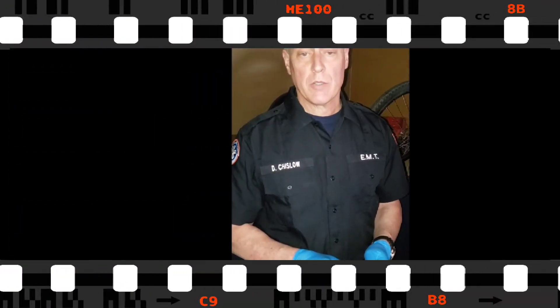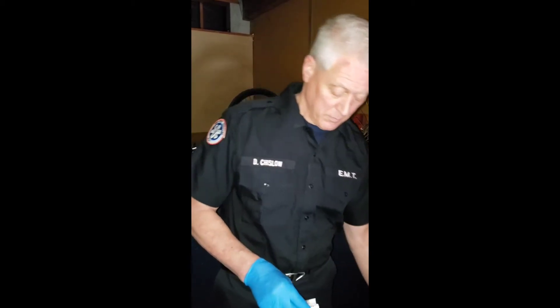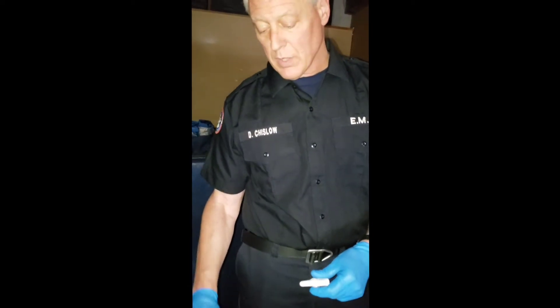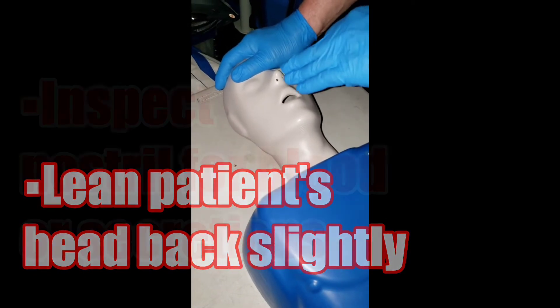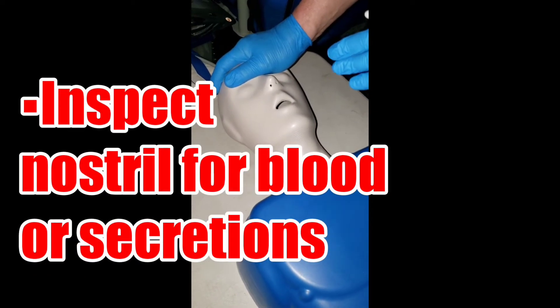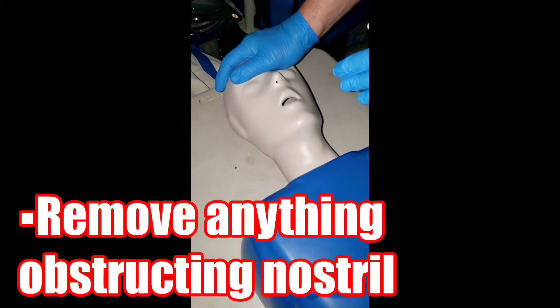To demonstrate usage of Narcan, remove it from its container. Make sure the patient's neck is in a stable, neutral position, slightly hyperextended — you're going to want to extend the neck slightly. Examine the nasal cavity for any blood or secretions. If there are any, make sure you try to remove them as best you can with a bulb syringe.